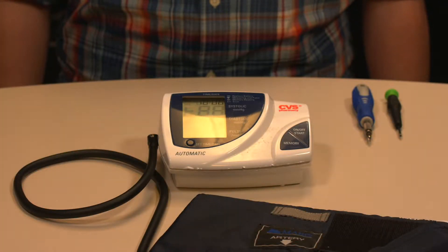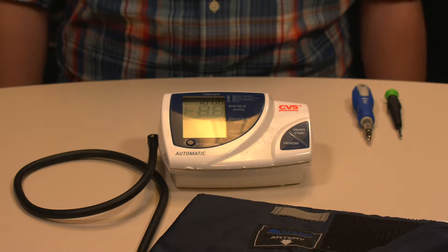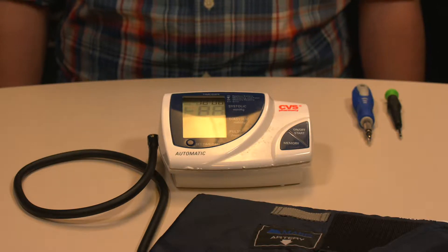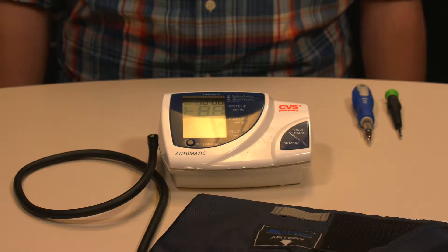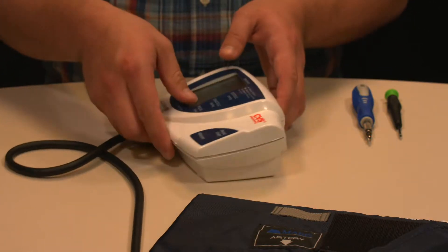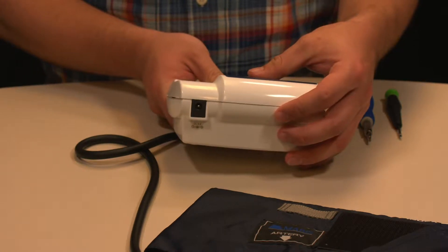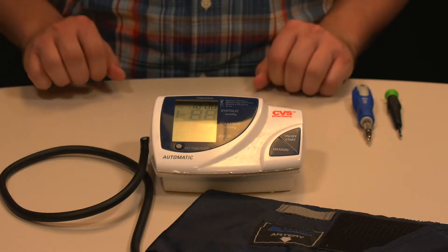This is the teardown of the CVS Pharmacy Automatic Blood Pressure Machine. The machine includes the device itself and a cuff. You can also purchase additional features that go with it, including a DC wall adapter, so it can run on both battery power and wall power. For the purposes of this demonstration, we just have it with batteries.